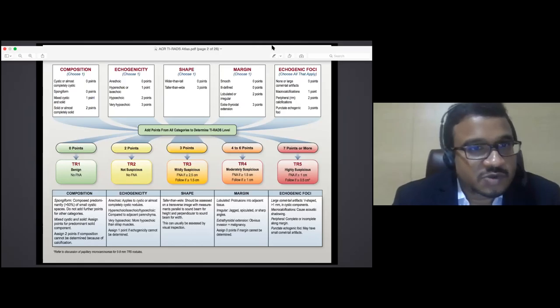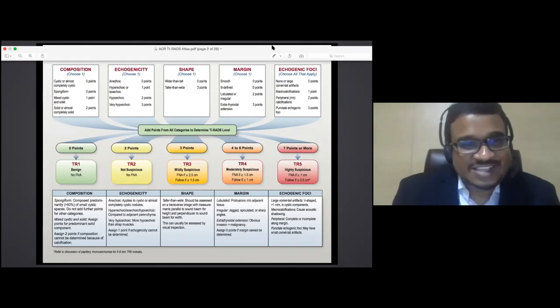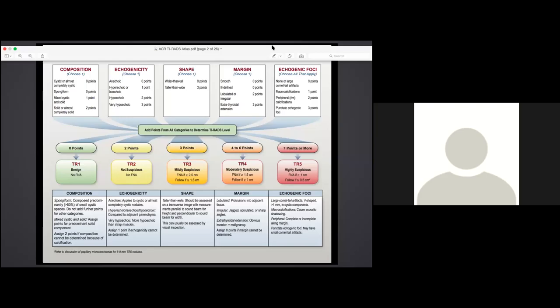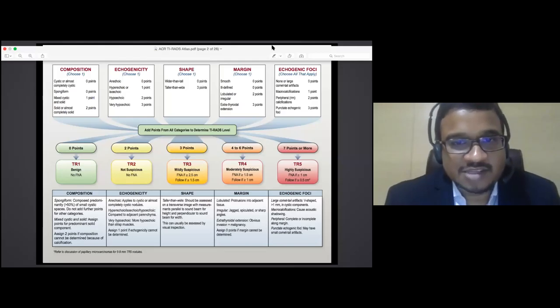And there's the next question, sir. What do you do if you have a highly suspicious ultrasound nodule, but the FNAC is benign? I had a case that even had nodular metastasis. So shall I take this question? Please, yes. If you have a highly suspicious ultrasound, but the FNAC is benign, why does this happen?